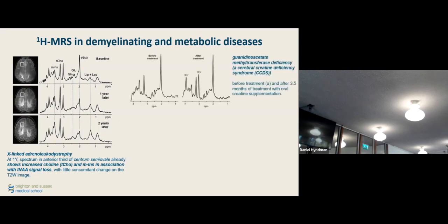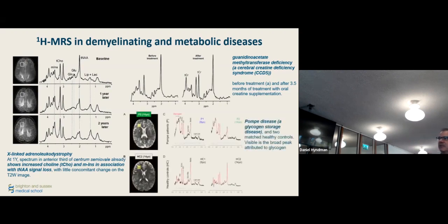This is a strange case of disease where there is creatine deficiency. This is the spectrum taken from a subject that has no creatine peak, which is quite curious, but then, supplemented with creatine, the creatine peaks awaken to life following the treatment. I will skip the Pompe disease.